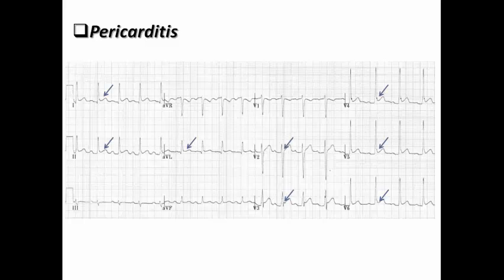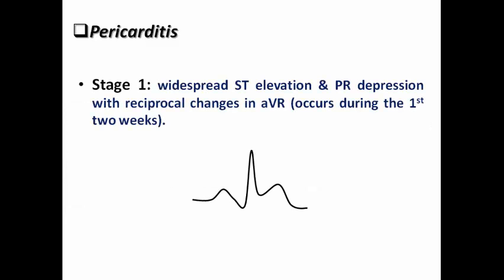In this ECG as well, we can see diffuse ST elevation. Most ECGs will show that leads 1, 2, AVL, and the precordial leads are involved. We can also see ST depression in AVR, though not involving V1 in this example. This ECG is also very suggestive of acute pericarditis.